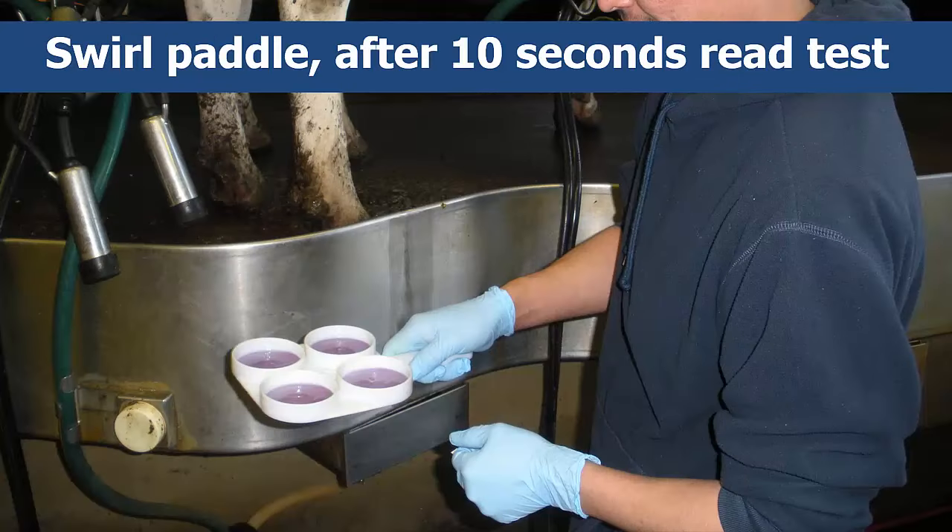After about only 10 seconds, you should read the test quickly. You'll score the reaction visually — basically, the more gel-like the formation is, the more seriously the cow is infected. The reaction generally disintegrates quickly, after about only 20 seconds.